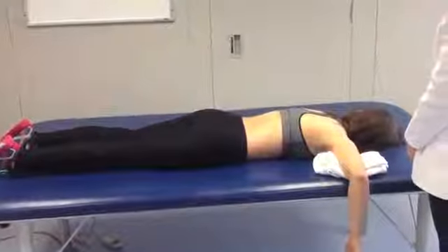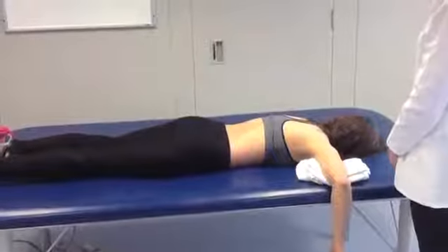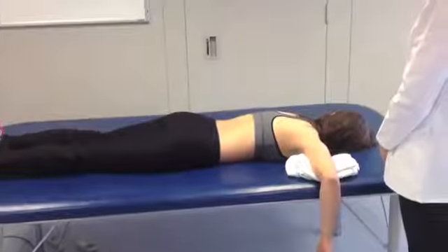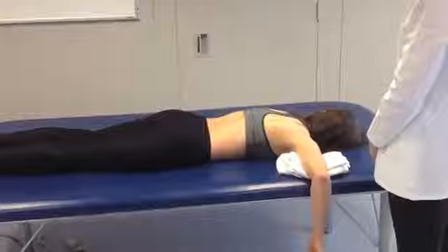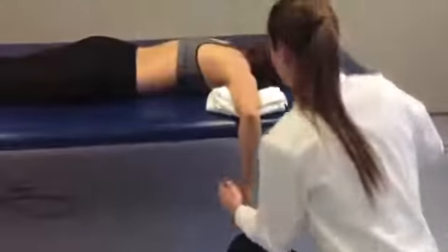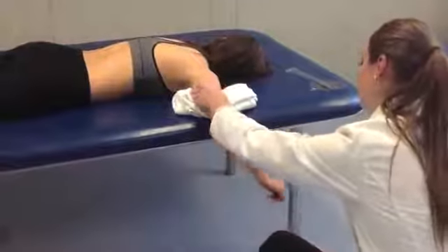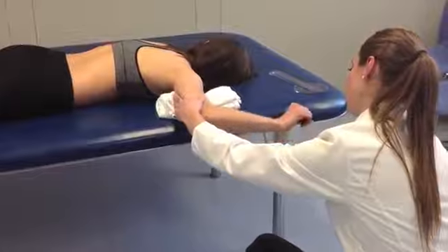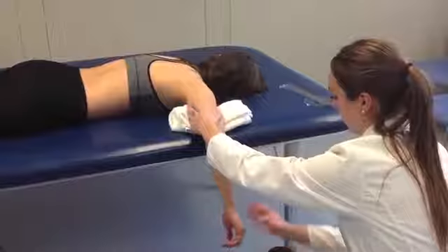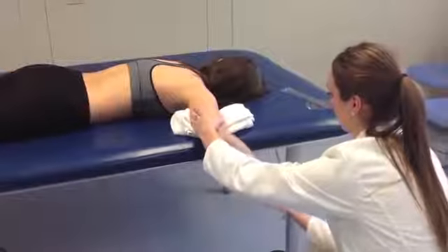The therapist should position themselves on the side of the extremity being examined. The therapist should first request the patient to take themselves through the active range of motion, then follow by guiding the patient through their passive range. Therapist should make sure patient can pass through 0 degrees. Kat, I'm going to ask you to bring the top of your hand up towards the ceiling. Good, and go back down. Now I'm going to do the same thing, so just relax.